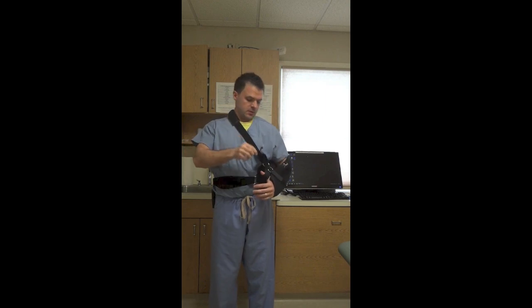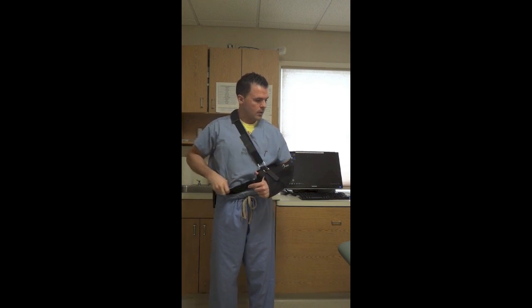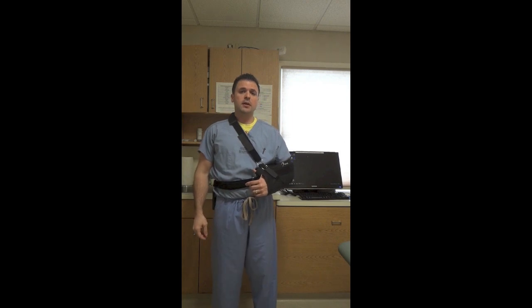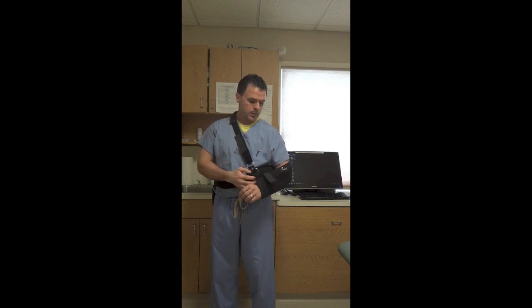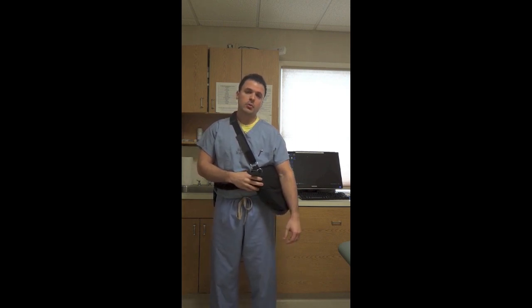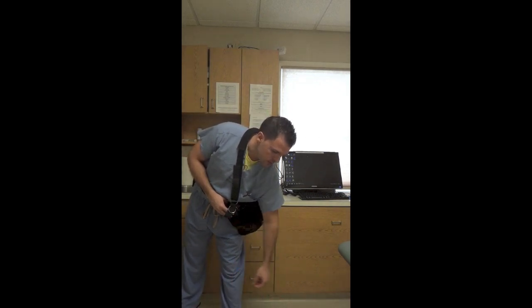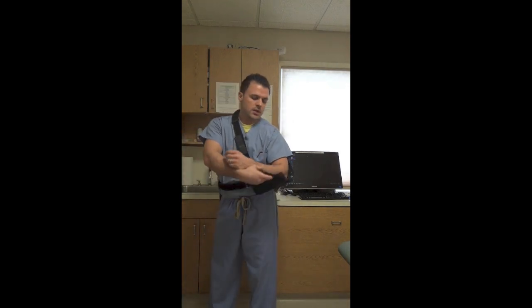Then just readjust the straps to a comfortable position. To do your pendulum exercises on a daily basis, undo this one strap, take your thumb out of the loop, and at the same time you can do your elbow range of motion — straighten your elbow all the way out, bend it all the way up. Lean over, then do your pendulum exercises, moving in a circle that's about a foot and a half in diameter. That's what you do on a daily basis, just to get your shoulder and elbow moving.